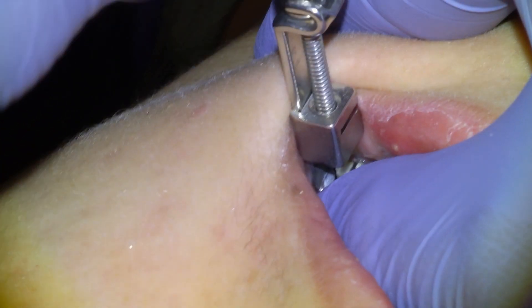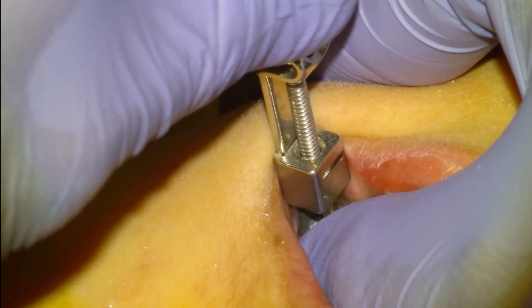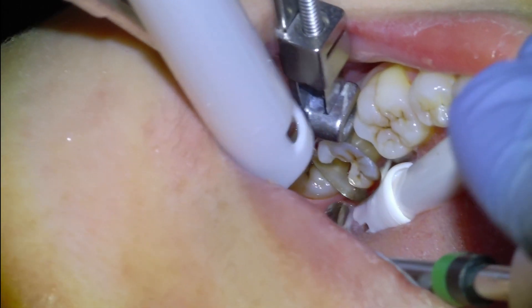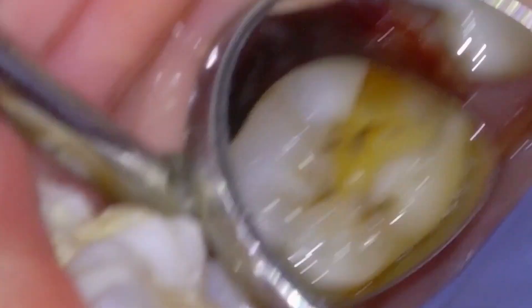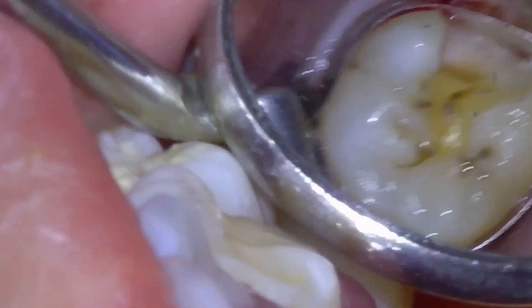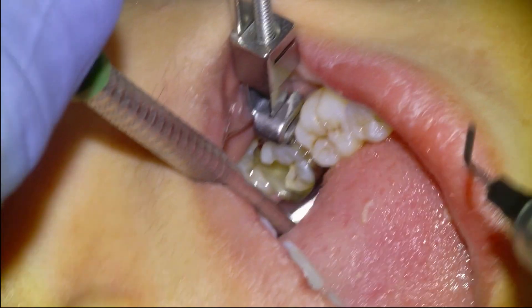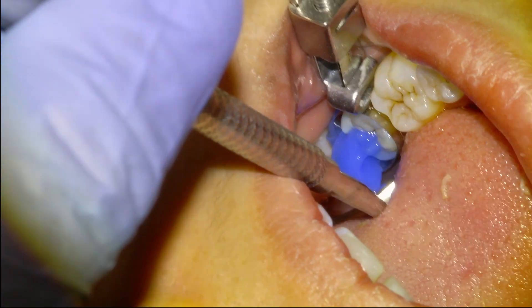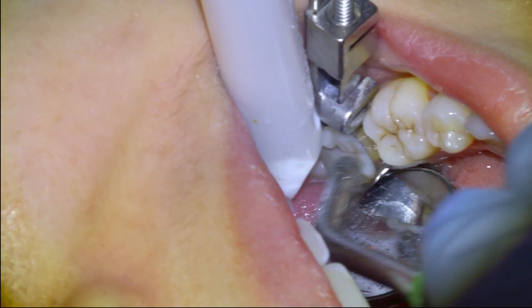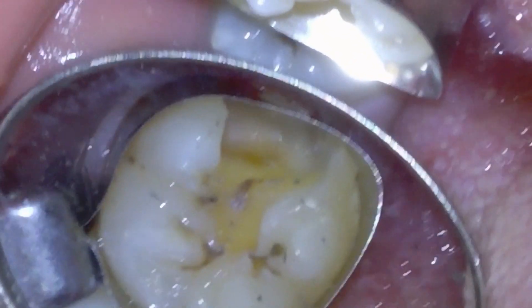I've found that Equia Forte has a great seal and the pulps generally react favorably in a situation like this. We're going to condition the tooth for bonding with a five-second phosphoric acid etch, then rinse thoroughly, dry it mostly, and apply our Equia Forte.